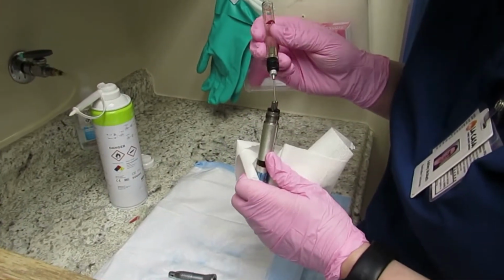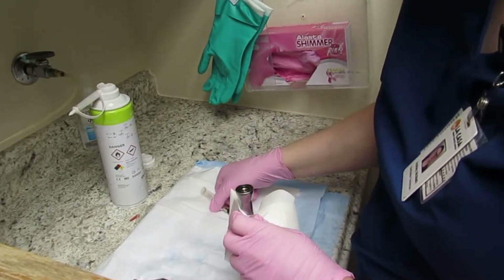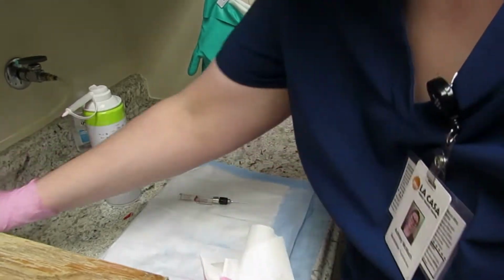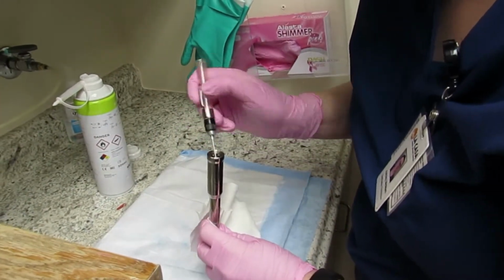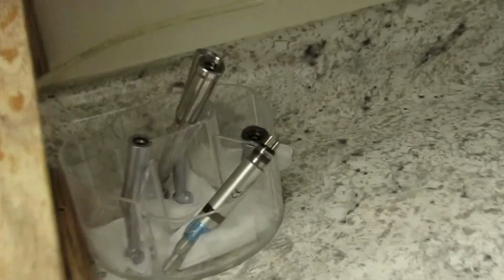Here we are using an oil. For high speeds, drop 1 drop into the drive air tube or into the bottom end of the handpiece. For low speeds, drop 1 drop into the bottom end as well. And again, place all handpieces in an upside down position for a minimum of 2 hours.